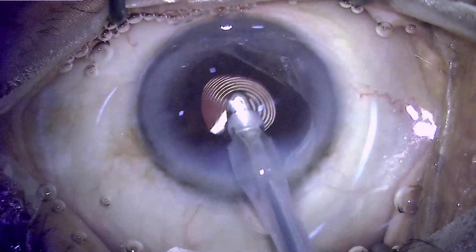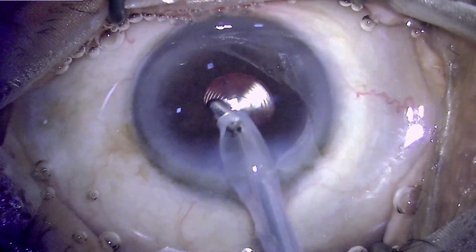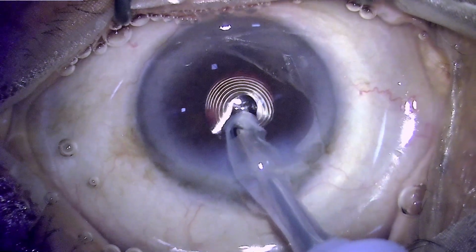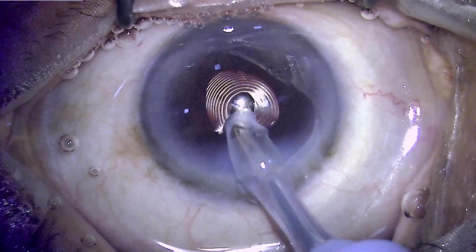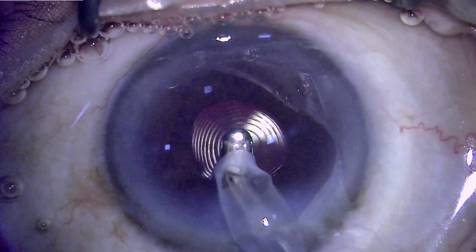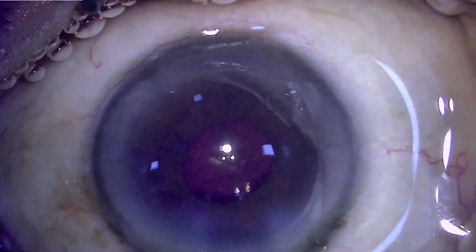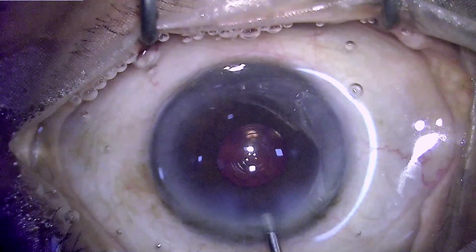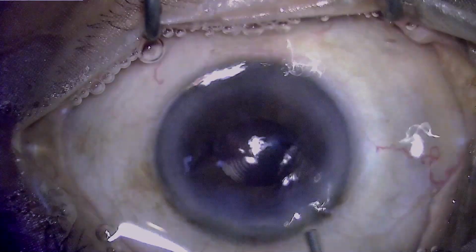That means the IOL is going to function well. At the same time, the concentric rings also have to be aligned. So all these four factors, which I will mention again: the center of the pupil, the reflexes from the anterior surface of the IOL, and the concentric rings, if they are all well aligned, the patient will have full use of the multifocality of the IOL.